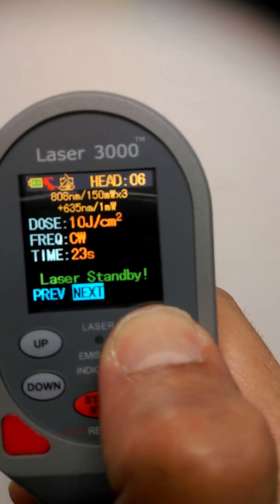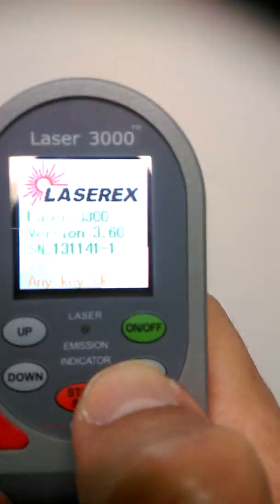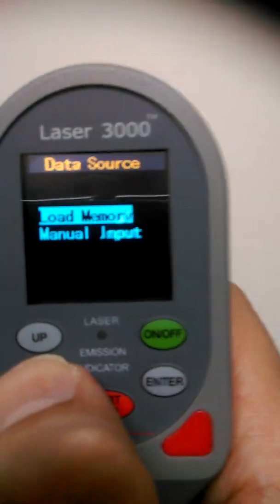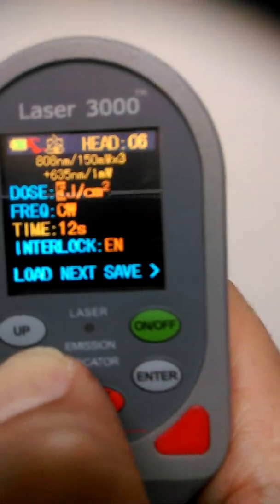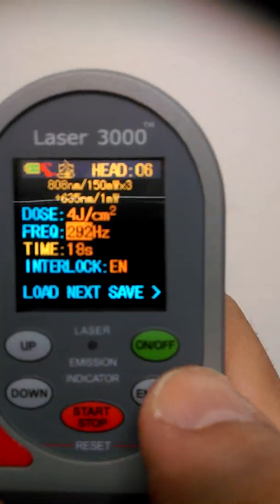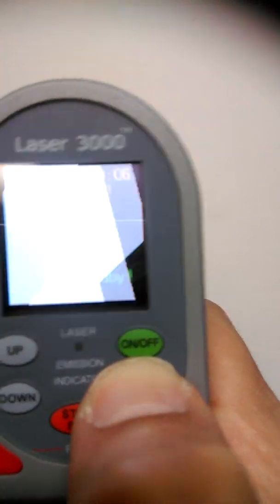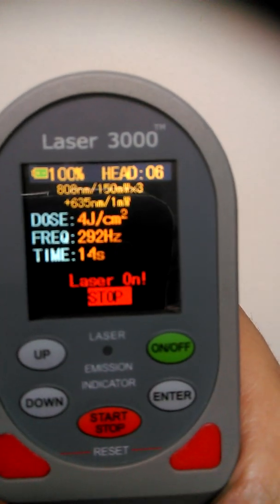All the dosages shown so far have been in continuous wave. If you want to use it in pulsing mode, there are seven frequency options from 73 Hz up to 4,672 Hz. Let's do a pulsing example. Go into the nines, then down to manual input, press enter. Let's set four joules pulsing. Press enter — four joules is there. When you get to frequency, it says CW for continuous wave. Press up and select 292 Hz. Press OK, next, laser safety glasses are on, and away we go. It's now delivering four joules at 292 Hz.